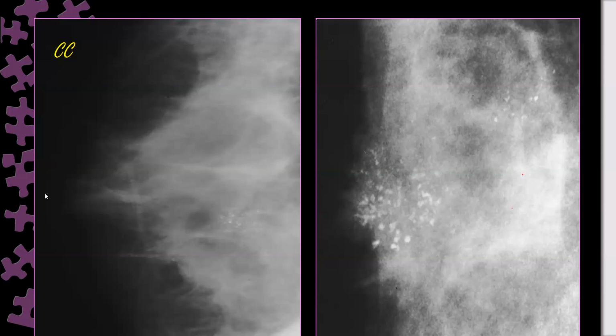This is the nipple because it's suboptimal. This is the nipple. Here is the nipple. Even not the whole view is visualized, part of a CC view. It is a part of CC view or suboptimal CC view even. What does it show, the CC view?